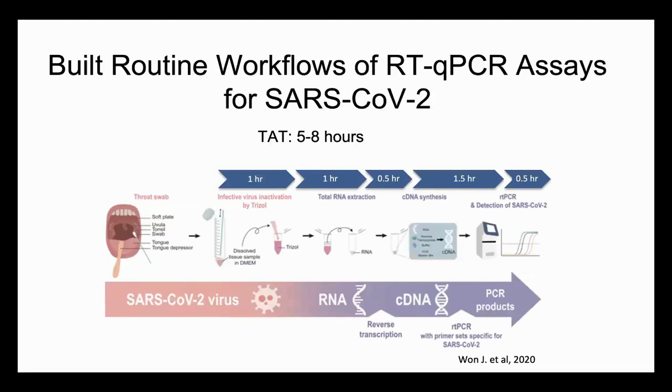Then we built a routine workflow of the test for our lab. The whole process could finish in 4 to 5 hours, but including specimen transport and waiting for enough specimens to run together, the real turnaround time usually varied from 5 to 8 hours in our lab.